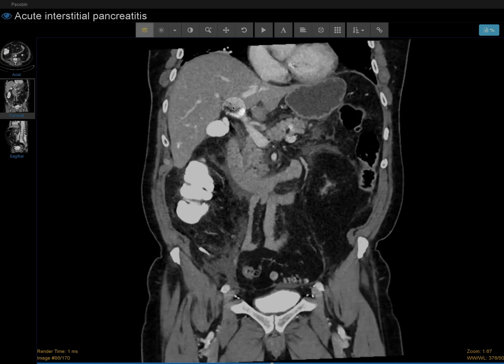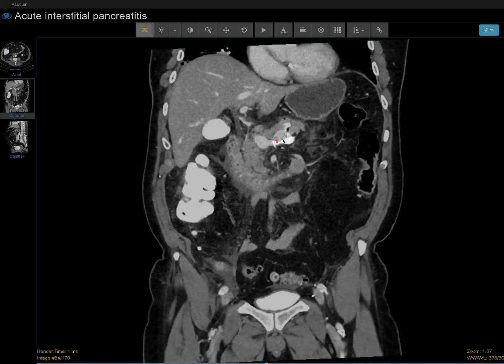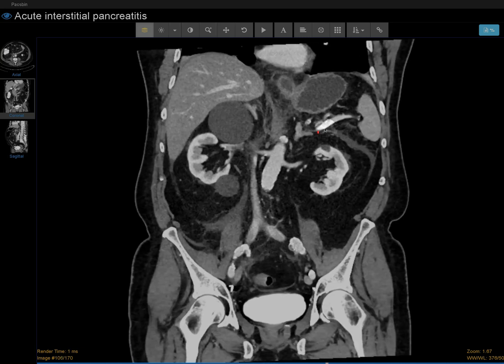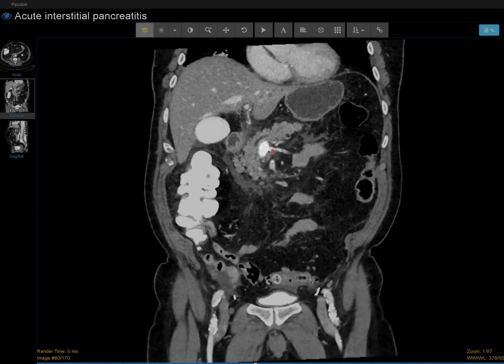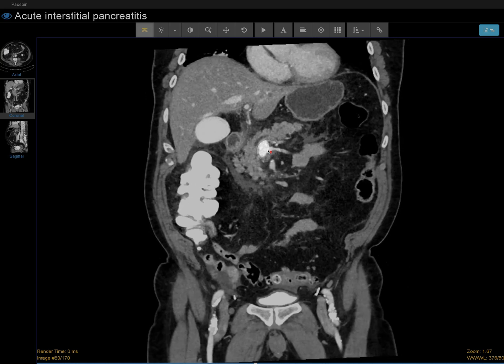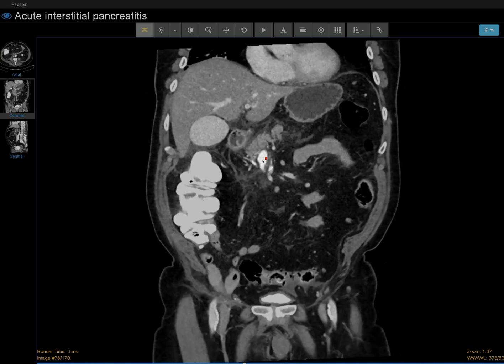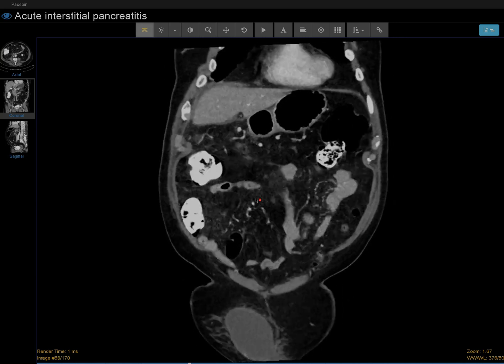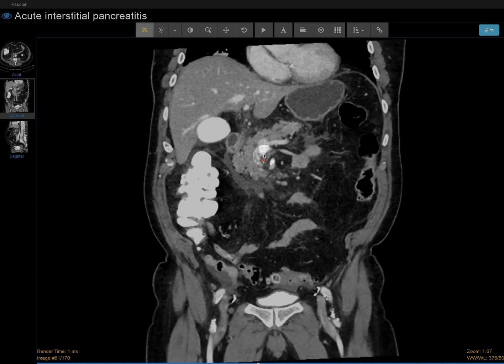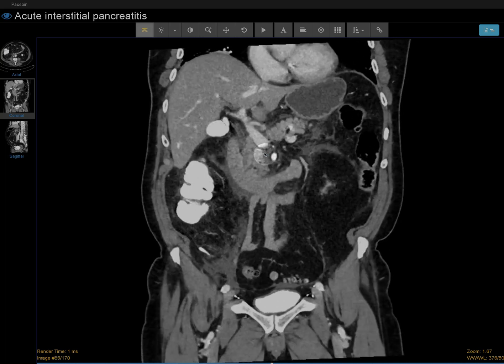So here we have our portal vein, left portal vein, right portal vein, main portal vein, splenic vein, follow it out. And this is the inferior mesenteric vein, and in this case, the inferior mesenteric vein joins at the confluence of the superior mesenteric vein and the splenic vein, and our superior mesenteric vein. And when I follow it outside, no thrombosis of the mesenteric veins.